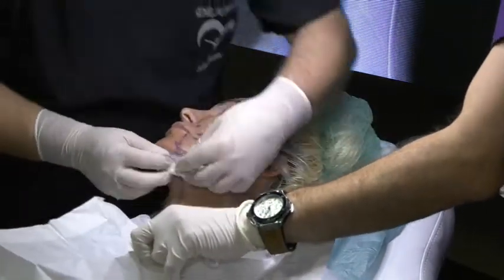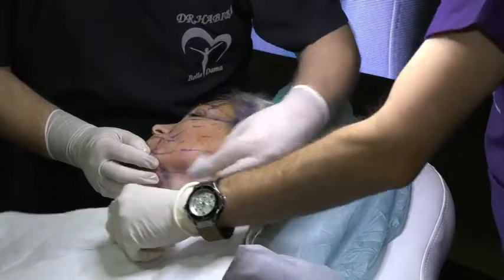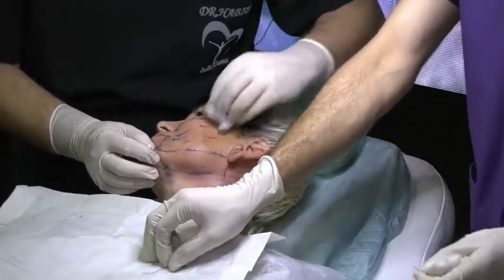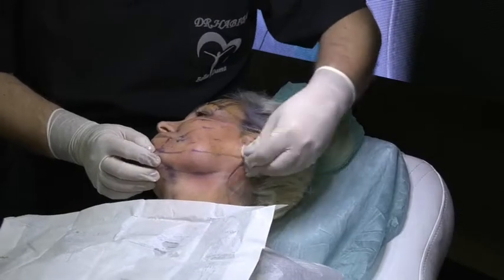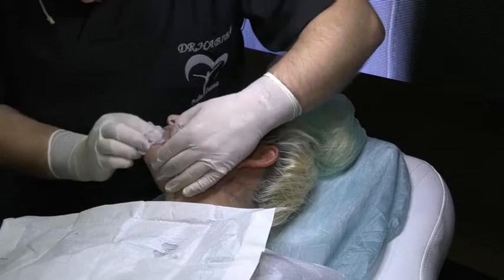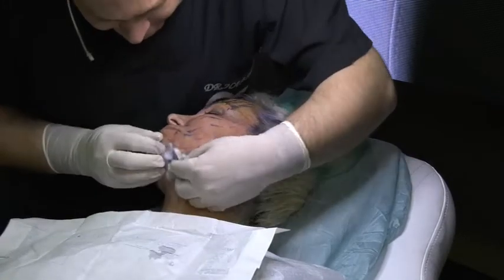Please guys, always put good anesthesia. 1 cc per each thread. 0.3 at the entry, 0.7 distributed at the lateral half of the tract or lateral third of the tract, please. Because you will be relaxed, your patient will be relaxed.